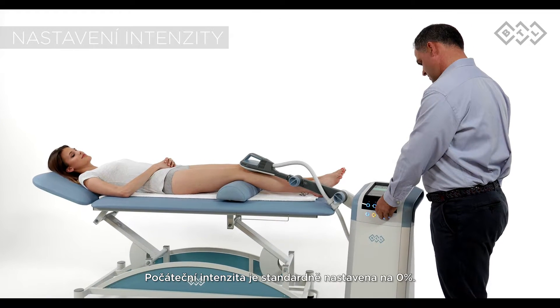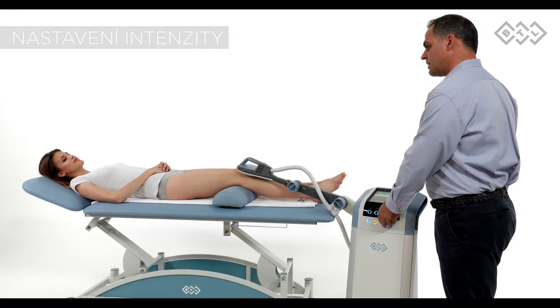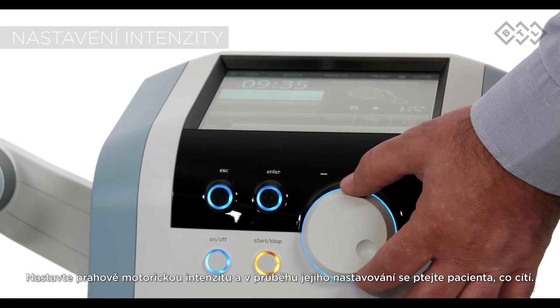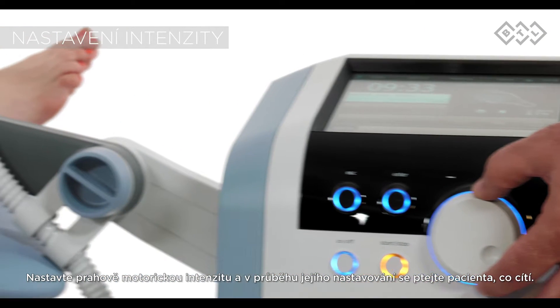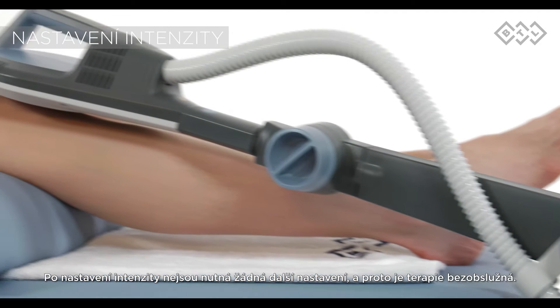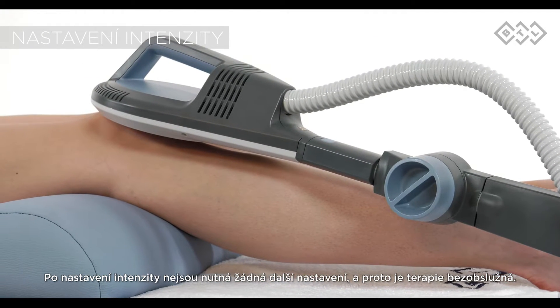The initial intensity is 0% by default. Increase the intensity to the motor threshold level while constantly communicating with the patient and getting their feedback. Once the intensity is set, the therapy from then on is operator free.